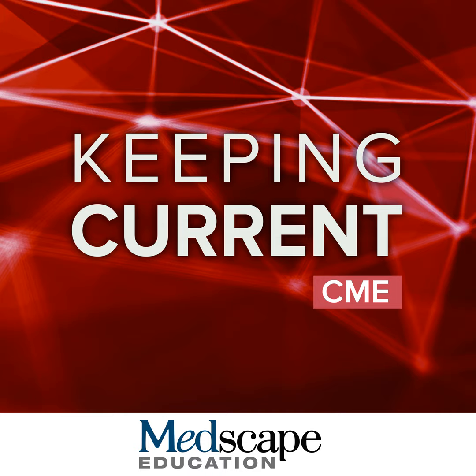Can you comment about how perfusion imaging is done in your practice and where you use it and the value of it in these various entities? Yes. So again, another great question. So the first thing I would like to remind our audience is that there are different ways of performing perfusion MR imaging. There are a couple of ways where you use contrast, and one type called dynamic susceptibility contrast imaging or DSC, you inject a bolus of contrast and you monitor the washing and the washout of that bolus of contrast with MRI.